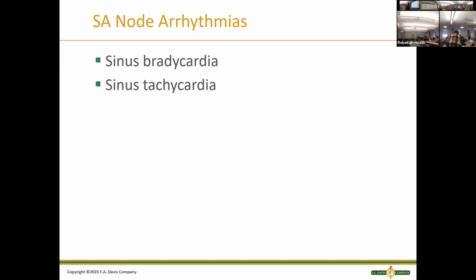That's where I would mark it. Then you measure, if you count up those boxes, sometimes you start right on the line. Yep, 12, 13. Right about in there.